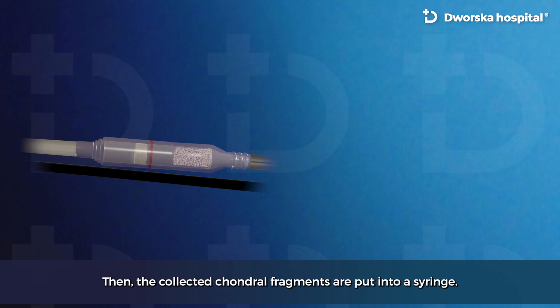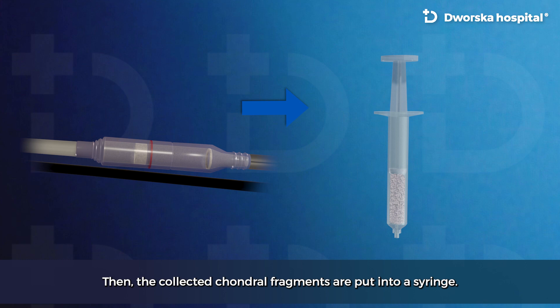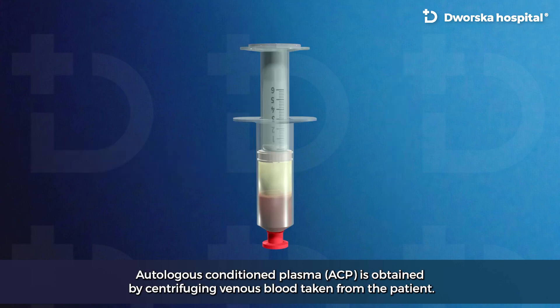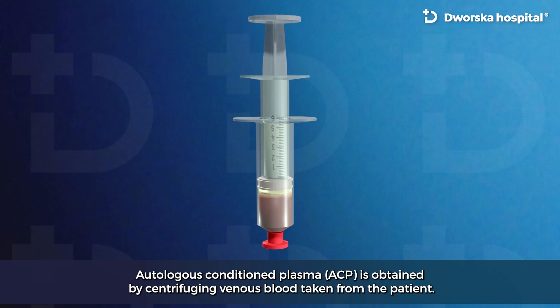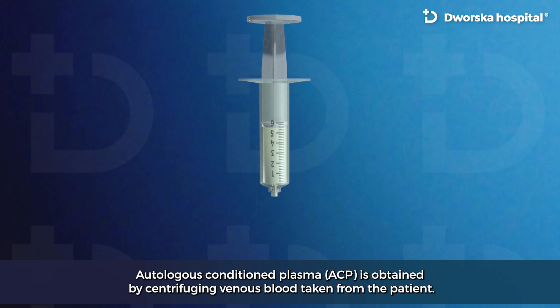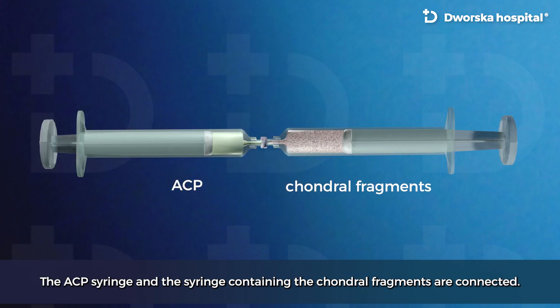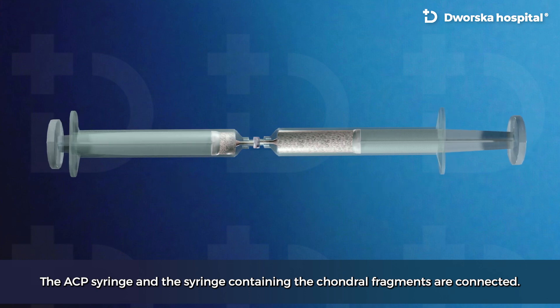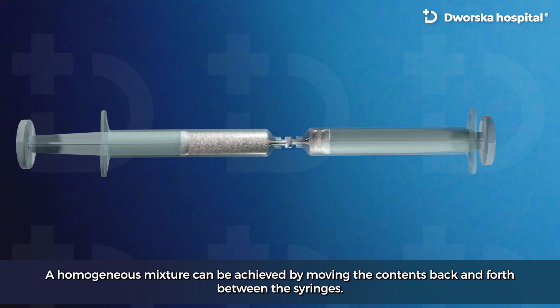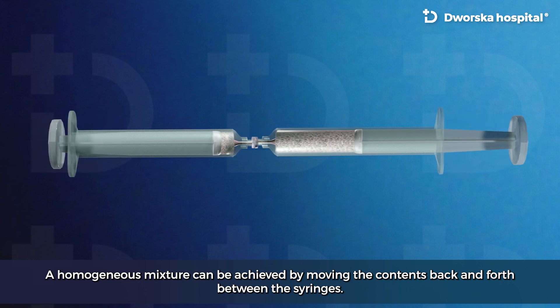Then the collected chondral fragments are put into a syringe. Autologous conditioned plasma (ACP) is obtained by centrifuging venous blood taken from the patient. The ACP syringe and the syringe containing the chondral fragments are connected. A homogeneous mixture can be achieved by moving the contents back and forth between the syringes.